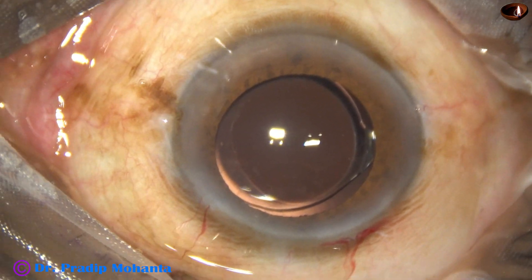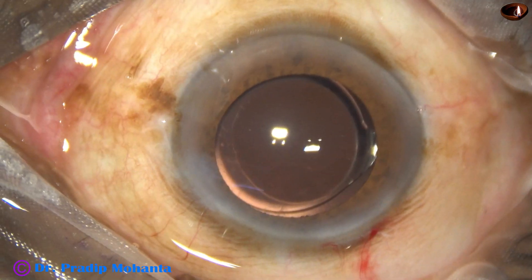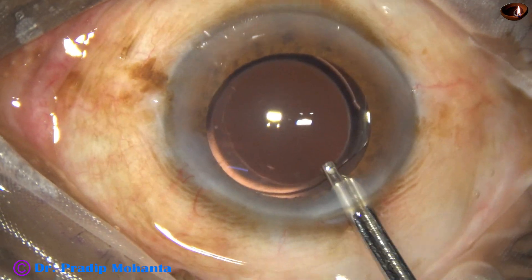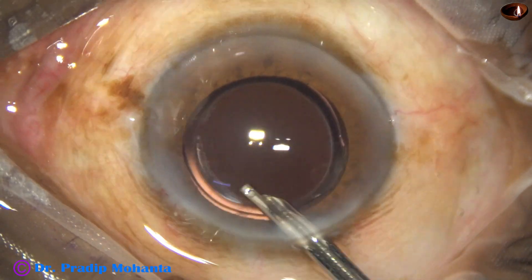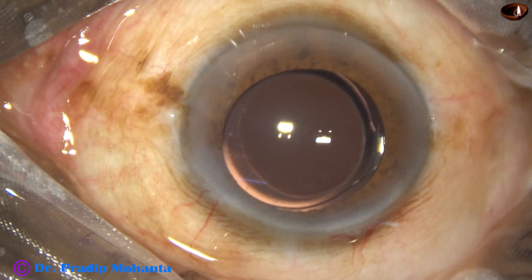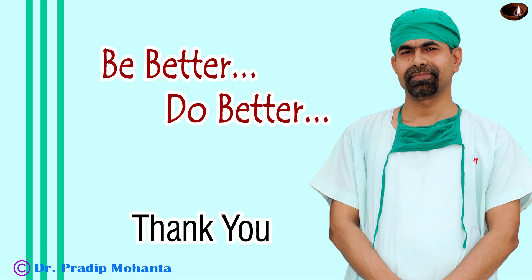This is moxifloxacin. The side port is closed by corneal stromal hydration. A final lavage with BSS is done. Any visco sticking to the corneal endothelium is removed at this time. The anterior chamber is nicely formed. Integrity of the wound is checked and a few drops of moxifloxacin are applied over the cornea, and the case is concluded.